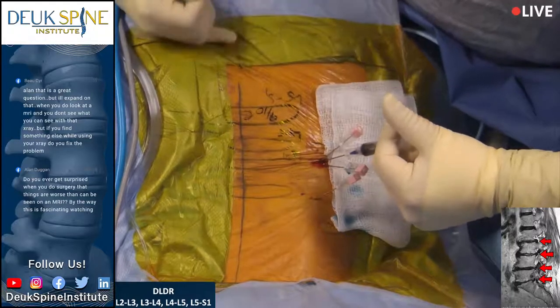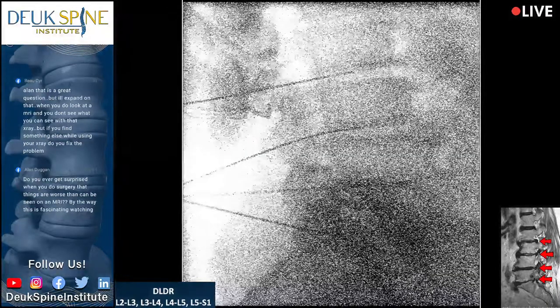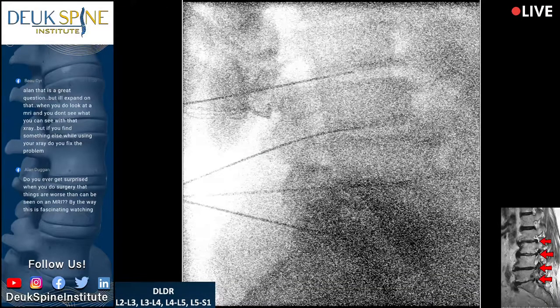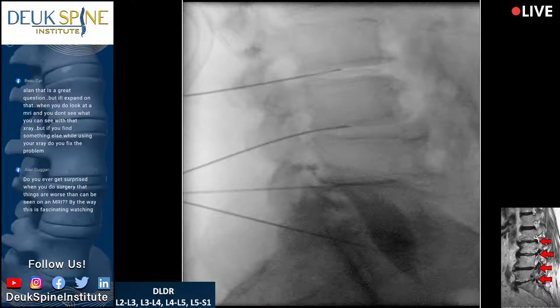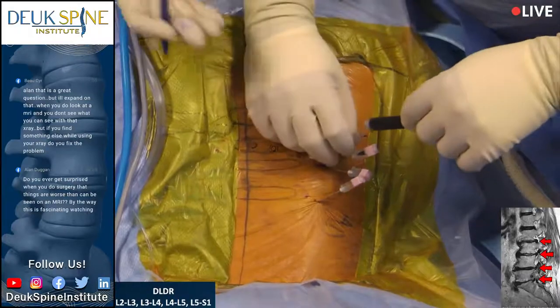How bad is that on a scale of 1 to 10? How bad did it get? A 10. That's what I thought he said. Is that where you get back pain? Yes or no? Yes. So it's concordant. All right. We're almost done, I promise. Lay still. We're going to put you to sleep, okay? I just need your help here.